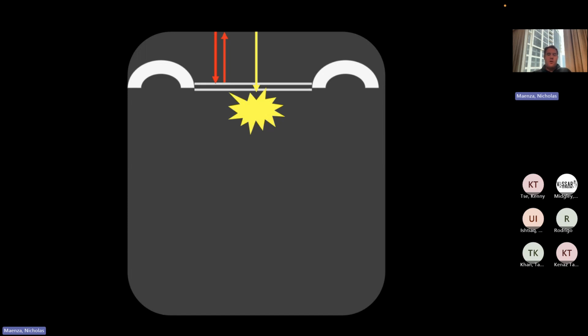So in a normal, healthy lung where everything is aerated, there's no pathology, there's no fluid, there's no consolidation, anything below this visceral and parietal pleura is just going to be artifact. There's no actual image being generated here. So it's super important to know. Again, anything below this line in a normal aerated lung is just going to be either artifact or not something we're looking at.